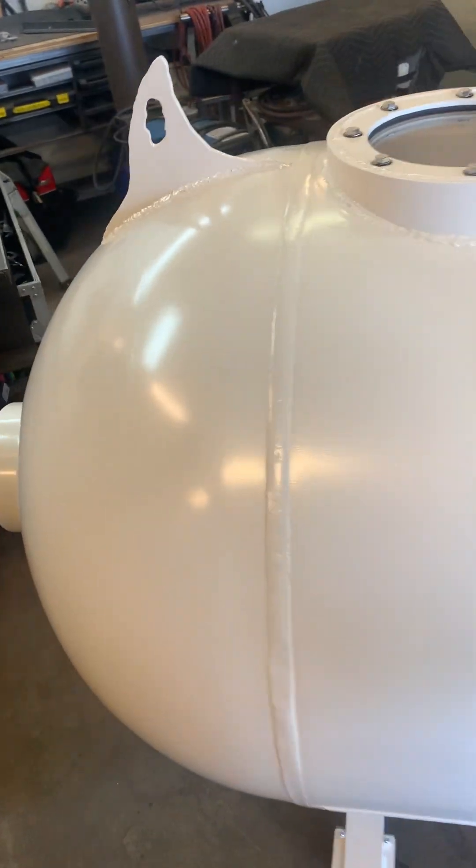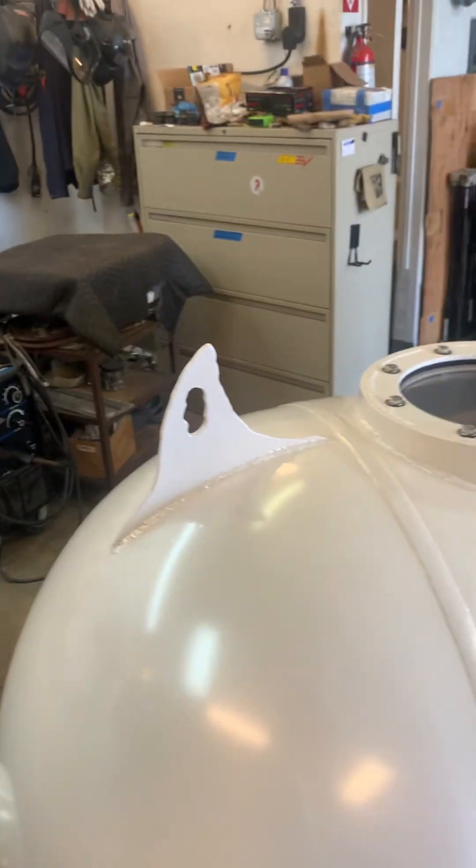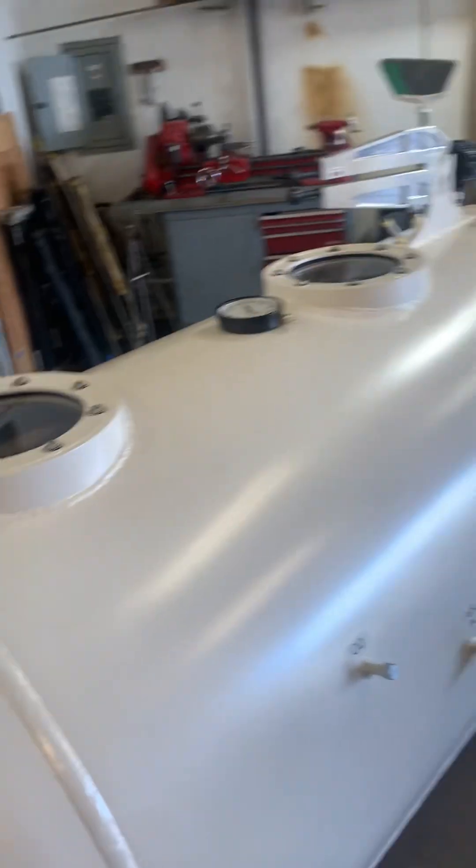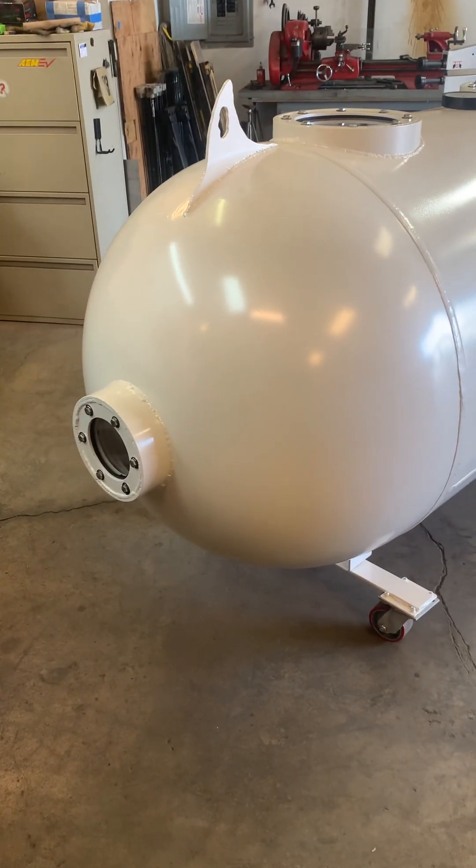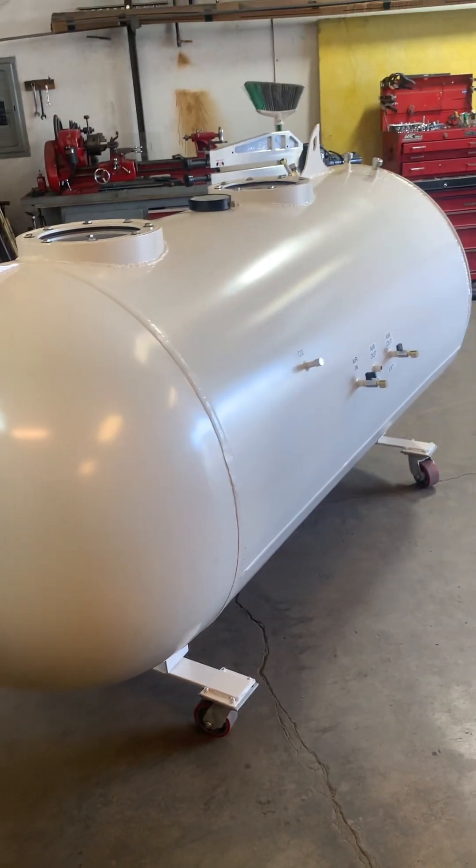So there you have it. They wanted some shark fins on there because they're going diving. And this is the final window out the back — I think it came out pretty sharp.